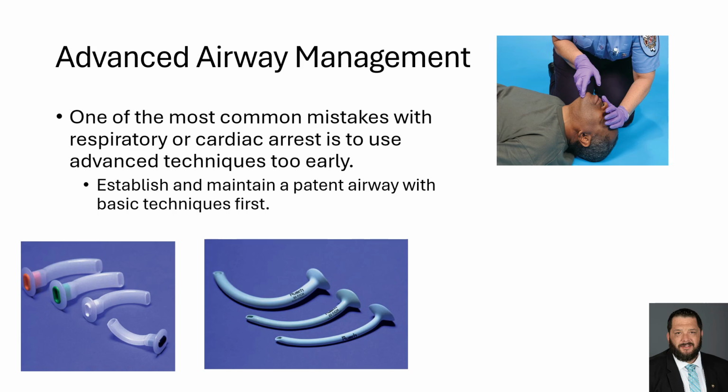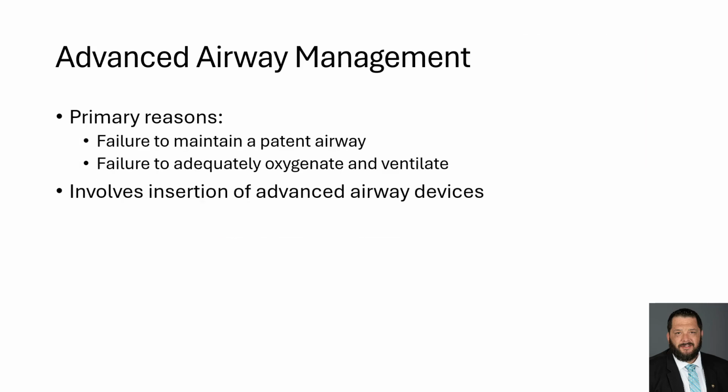You may revisit advanced airway procedures later in your patient care process due to the need for more definitive airway protection. It's not completely unreasonable that while you can maintain the airway early on with simple airway maneuvers, as you progress through patient care and the patient becomes more stable and you need to establish more definitive airway methods to intubate the patient, then that's perfectly reasonable. But remember, particularly as we're going through the initial and primary assessment phases, the most simple solution is often the best solution for that patient, especially considering the risks associated with advanced airway maneuvers and techniques.